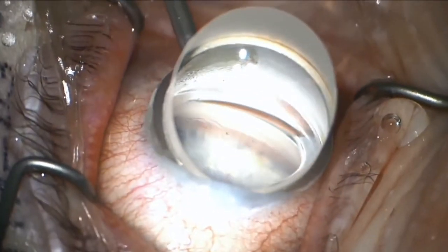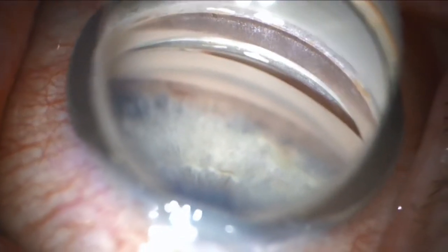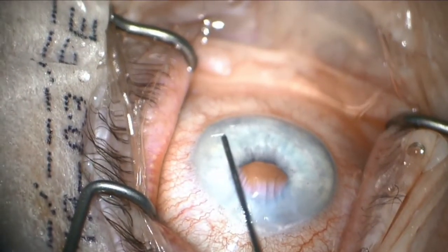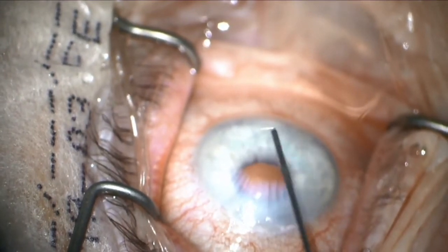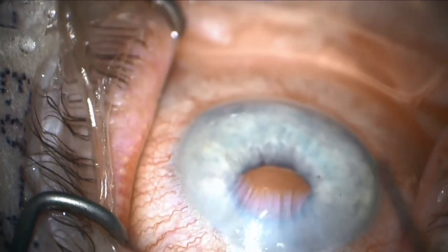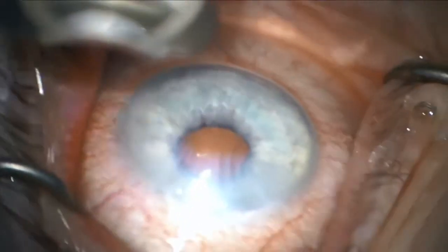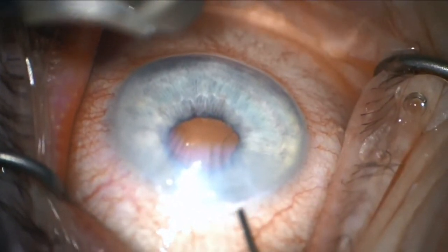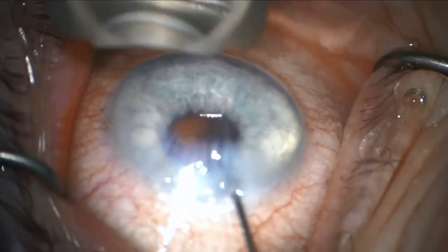We're using a gonio prism to visualize the structures of the angle. We're looking for the trabecular meshwork and looking for some heme there to reflux back into Schlem's canal. Here we're inspecting the eye stent device to make sure it's loaded correctly in the eye stent holder, and then we're going to place the gonio prism back on the eye and visualize the angle once we have inserted the eye stent through the temporal clear corneal incision that we've made for cataract surgery.